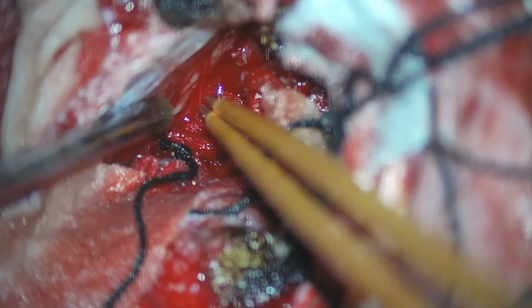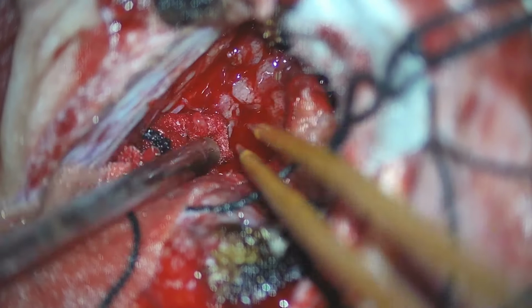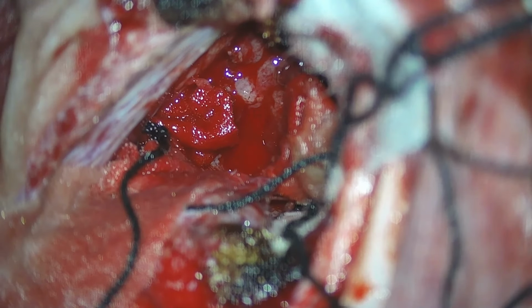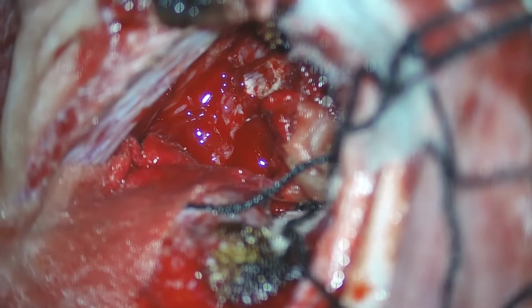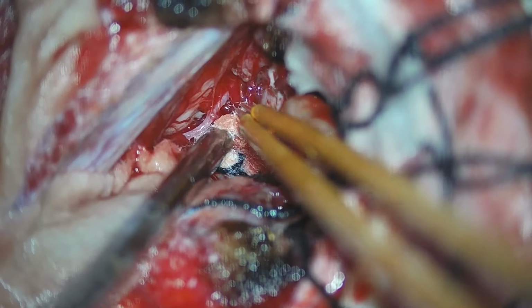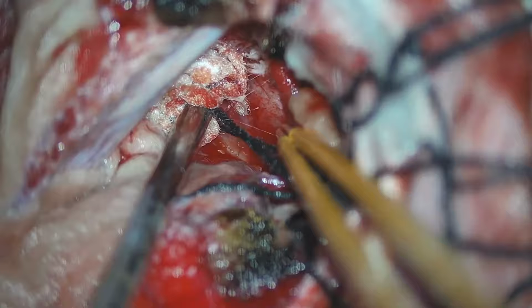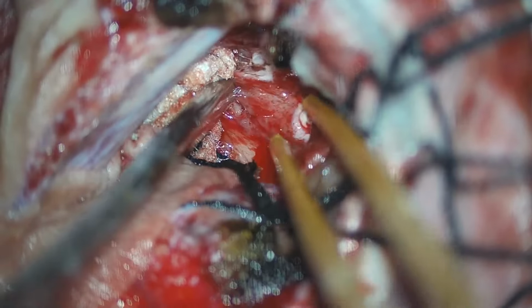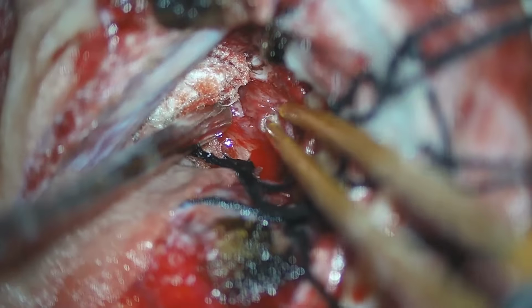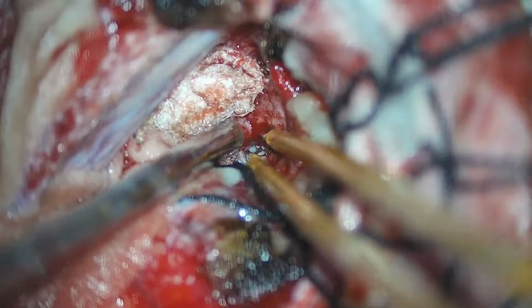The ACAs are slowly separated from the tumor tissue using a surgical sheet and cottonoid. Later, the remaining part of the tumor that is present in the medial aspect is being aspirated simultaneously with the suction and coagulated with the bipolar, and we slowly follow the tumor to its origin, that is in the corpus callosum. We remove any attachment that is present in the corpus callosum, and after that we proceed with the hemostasis.